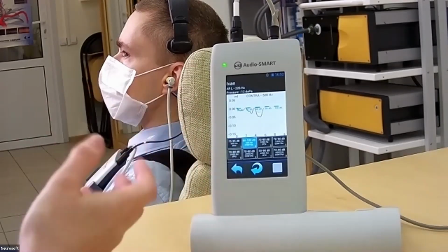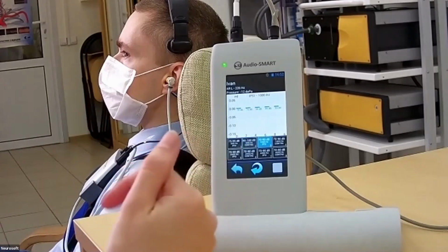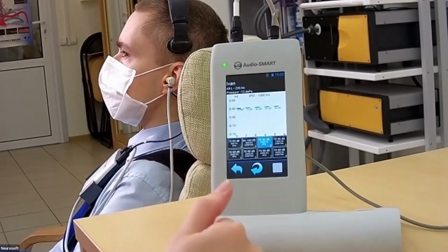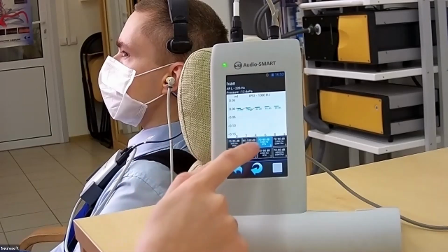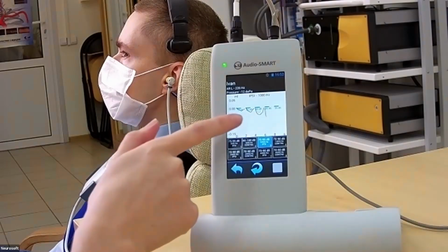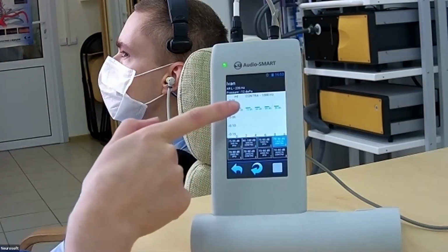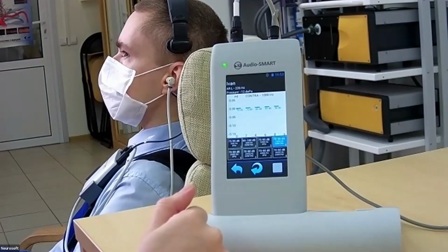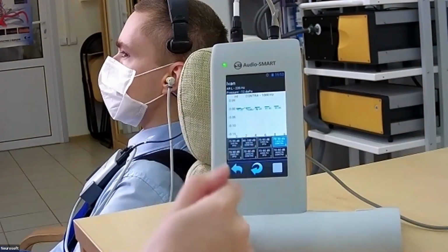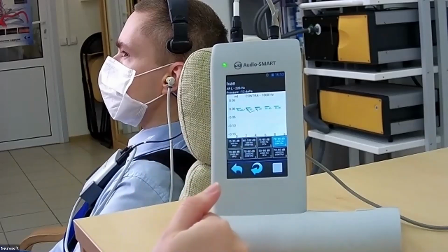So one by one in my template, I will show you how you can set up the template after the finished. So after that, we go to the 1000 Hertz, and you see the threshold for detecting the reflex. Now the curve will move against it, and the reflex will be detected.